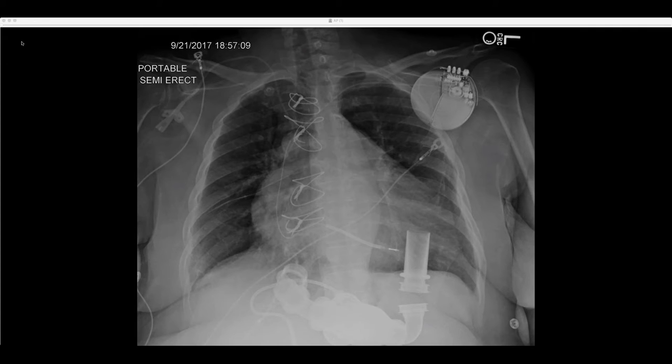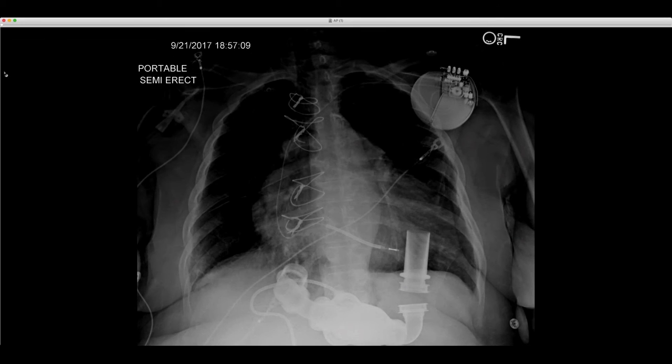I think the distinction you make there is important, since it's not a thrombus in the lumen, so you have to treat this surgically and not with anticoagulation, right? Right. I'm not showing you the follow-up, but they stented it and opened up the lumen. It may not be a cure, but they knew anticoagulation is not going to help, so they just mechanically expanded it. We'll see how it does over time because the problem still remains that the bend relief is dislodged, so the flow is not going to be the same through that.